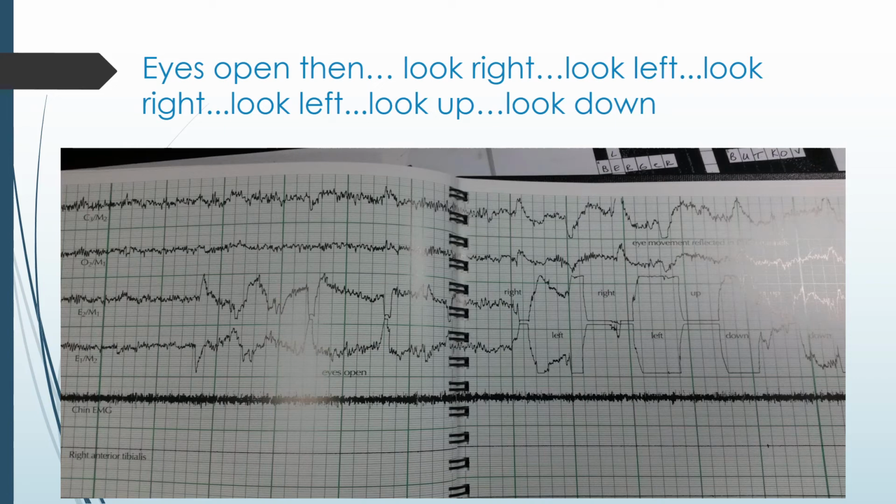Now the patient's instructed to look left, and you see again how the pens deflect. Look right, look left, then they have the patient look up, and then they have the patient look down. You can't really see there on the very end. So this is an example of what an actual tracing looks like with the eyes being moved following instruction.